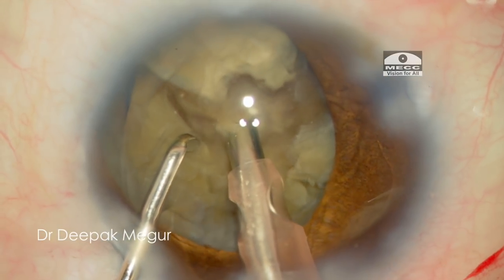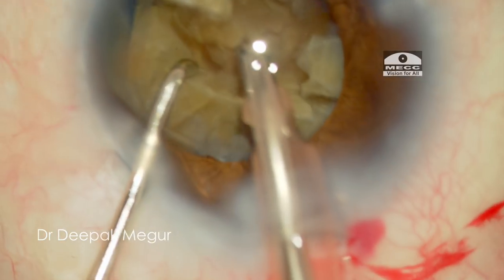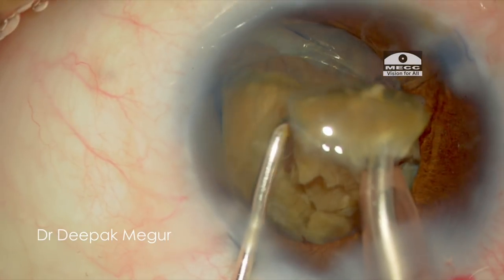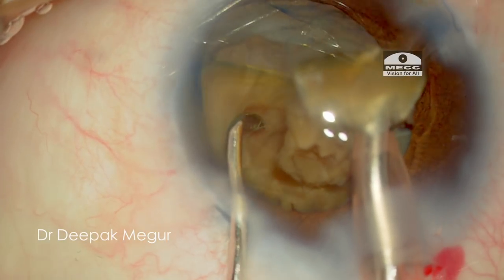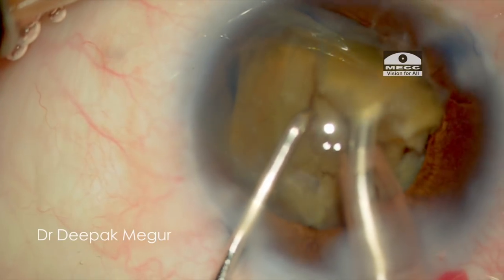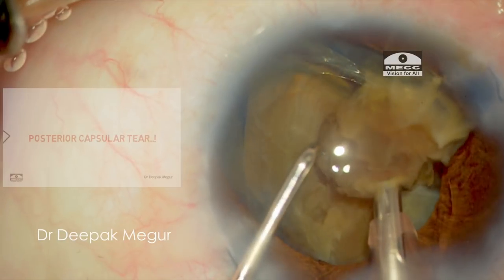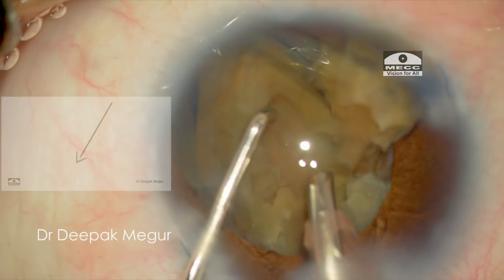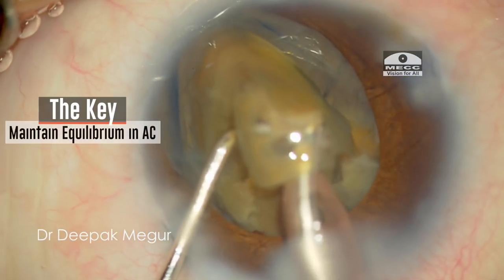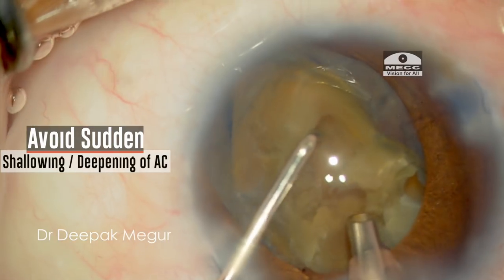In this fragment, I am finding it tough to separate the posterior plate, manipulating at the base of the fragments to separate them laterally. I don't want to exert any pressure because I am worried about the torn rhexis, so I am trying to use as minimal force as possible. Finally, I achieve the separation using the FACO energy itself at the base. The problem of continuing FACO with a torn rhexis is that the tear can extend posteriorly across the equator to involve the posterior capsule, resulting in a dropped nucleus. To prevent this, the goal should be to maintain a constant depth of the anterior chamber throughout the procedure, since a sudden deepening or shallowing can extend the tear posteriorly.